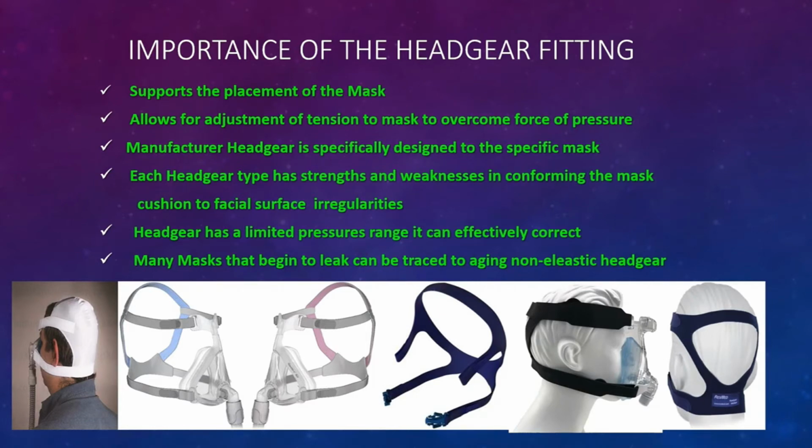That is, the points at which the head straps attach to the frame of the mask, which again attaches to the cushion, are designed to exert the maximum amount of pressure to spread the cushion over the face so that it can seal all of the irregularities of the face. I'd like to bring up one precautionary note: sometimes, in our urgency to seal the mask leak, we tighten the headgear straps excessively. This pressure can break down the tissue of the skin on the cheekbones, as well as place a lot of pressure on the back and neck, causing much pain.